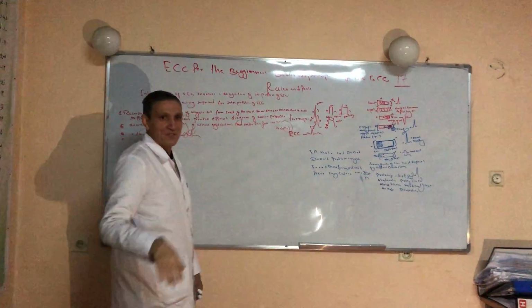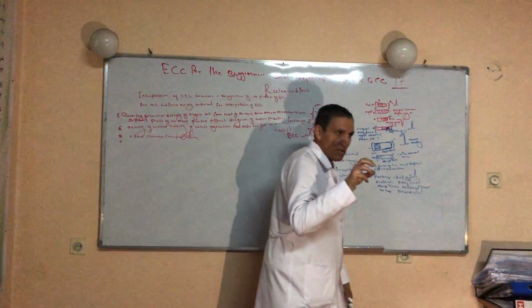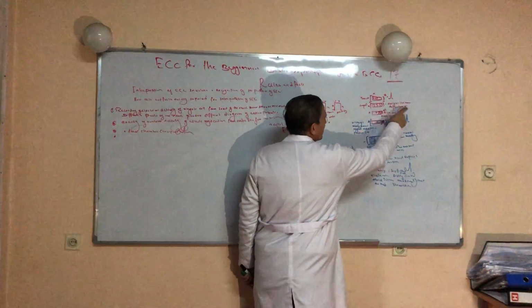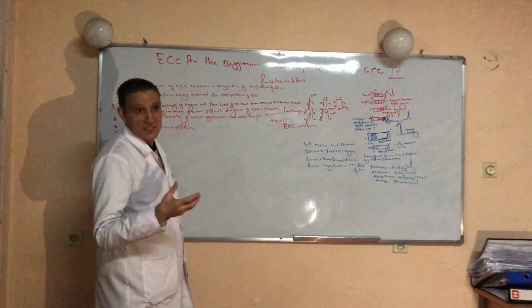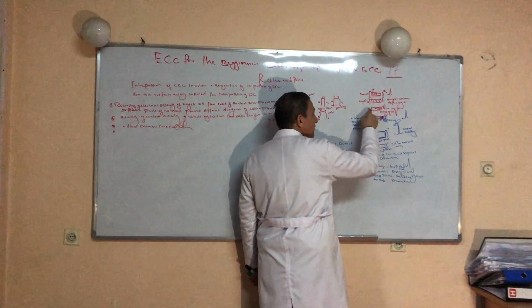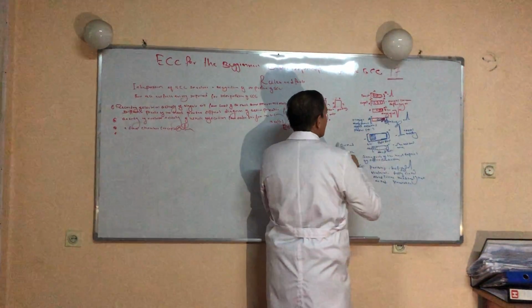Positive charge toward the positive electrode, the deflection is positive. When part of the myocardium is completely depolarized, in such a case there is no electrical activity. During this period, just a straight line is produced, and during this stage the heart does not accept further stimulation. Right now, when the positive charge moves away from the positive electrode, this is a negative deflection.